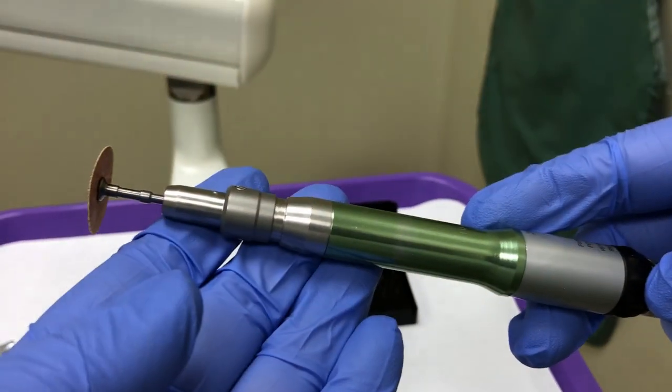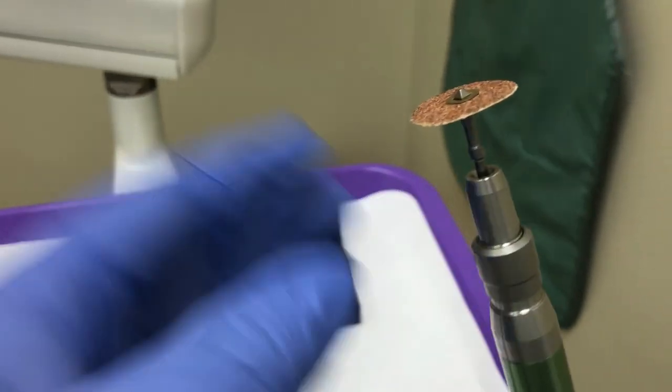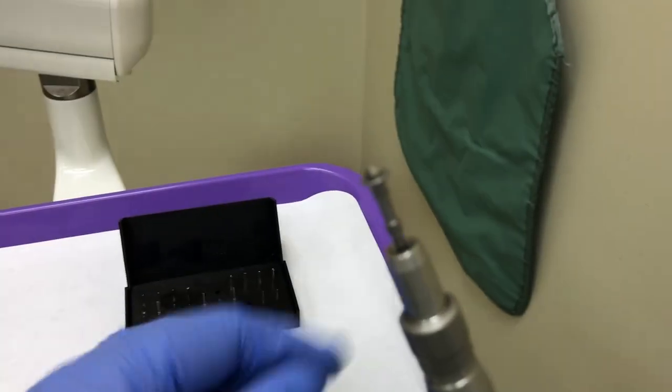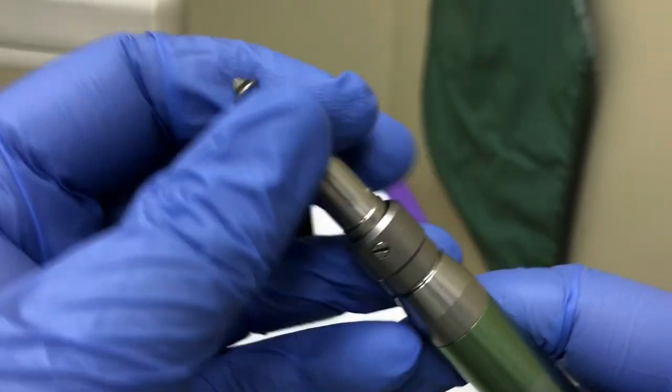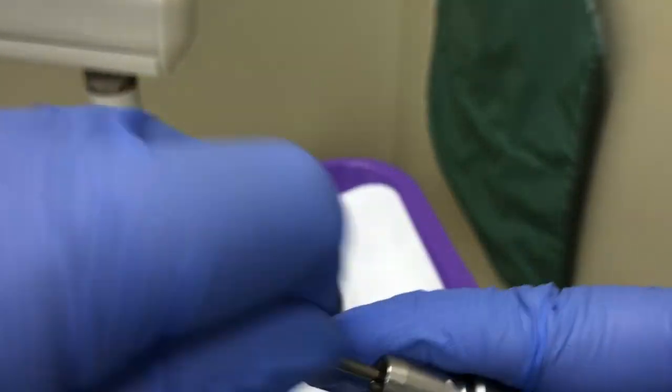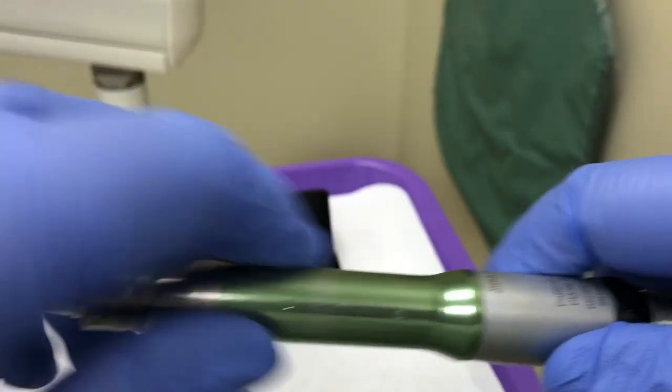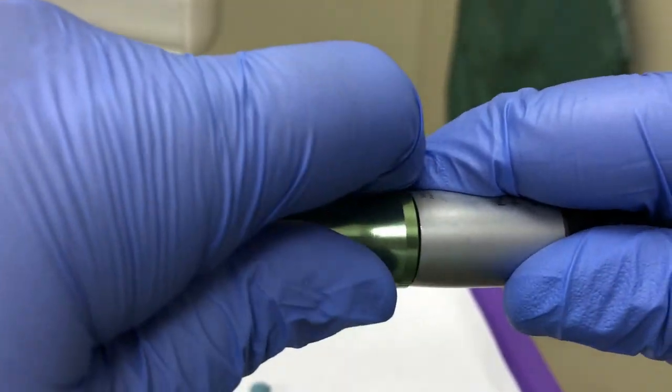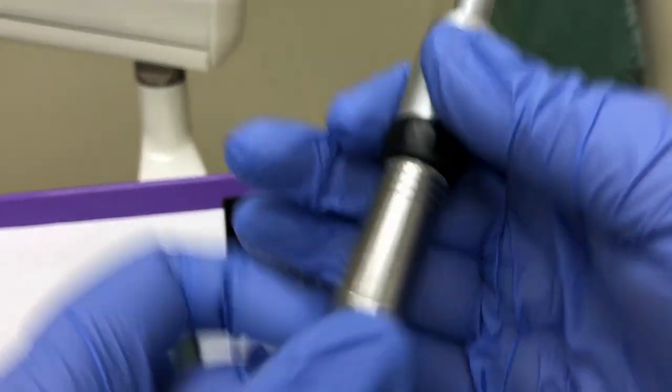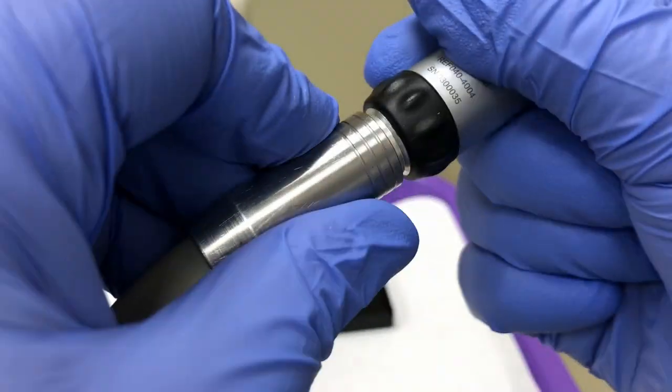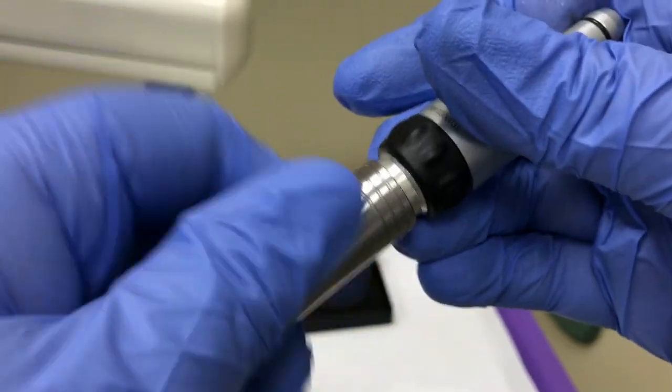To disassemble, remove the disc, unlock the straight attachment, remove the mandrel, and pull the straight attachment off the motor. Unscrew the coupler to remove the handpiece.